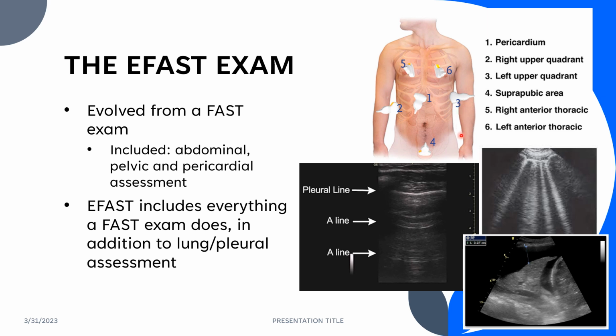That is basically going to be your whole abdominal portion of your Efast exam, and each of these images can usually be obtained very quickly. Of course, patient habitus, condition, and all those other things do contribute to this, but most of the time it's not a subtle finding when there is a lot of fluid somewhere.